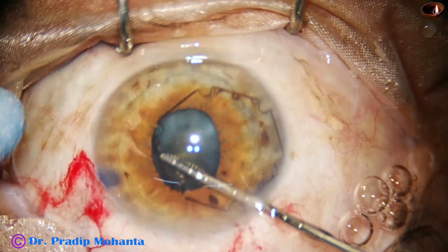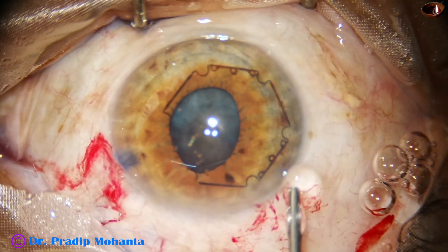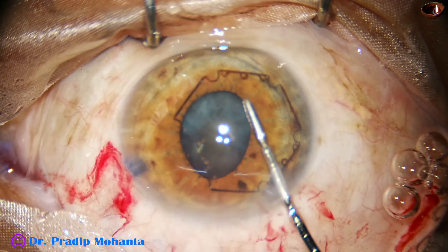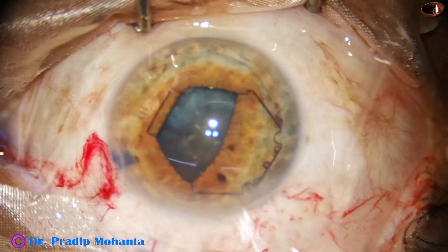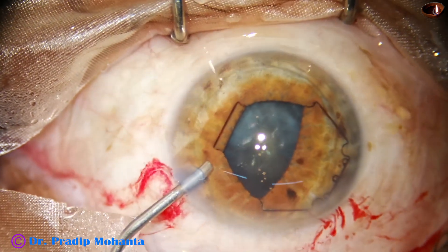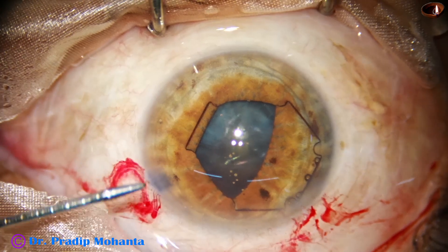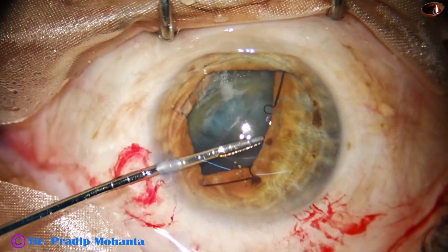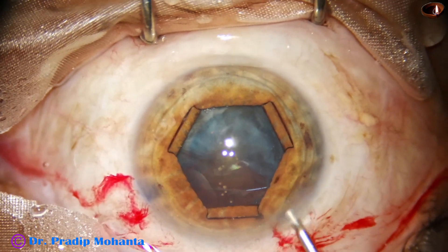I go in with the device, turn and flange. I tuck the flange towards 2 o'clock, and then I tuck the inferior flange towards 7 o'clock. Inject some more visco, take the B-hex forceps, hold the middle tab of the flange which is at 10 o'clock. And see the shape of the pupil — a beautiful hexagonal shape.